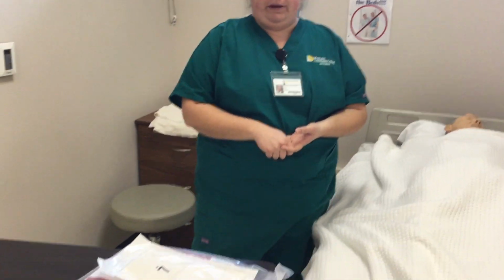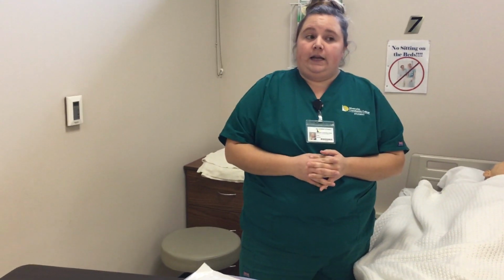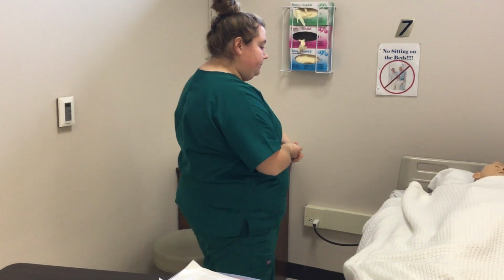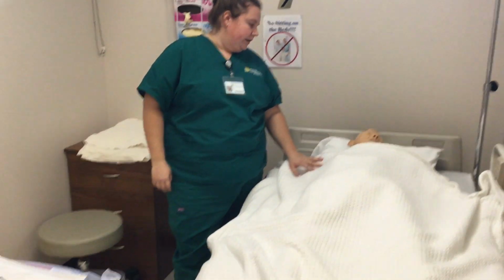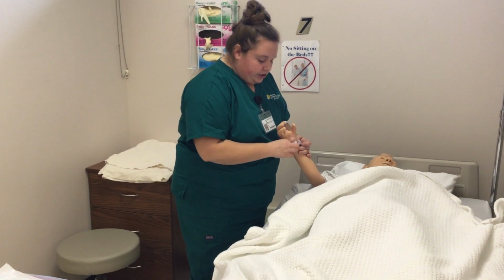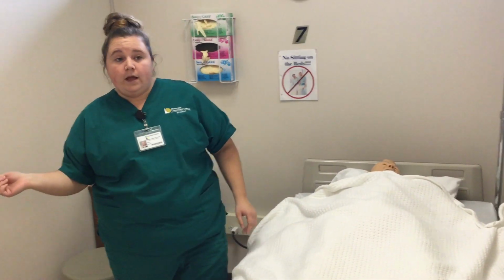I'm also going to review the medical record for any pathological conditions that may impair the passage of the catheter, including the patient's gender, age, and allergies. I'm going to perform hand hygiene. Introduce myself: Hi, I'm Katie, student nurse from Montcalm Community College. May I have your name and date of birth, which are 2 patient identifiers, check the wristband, and then compare it to the medical record.